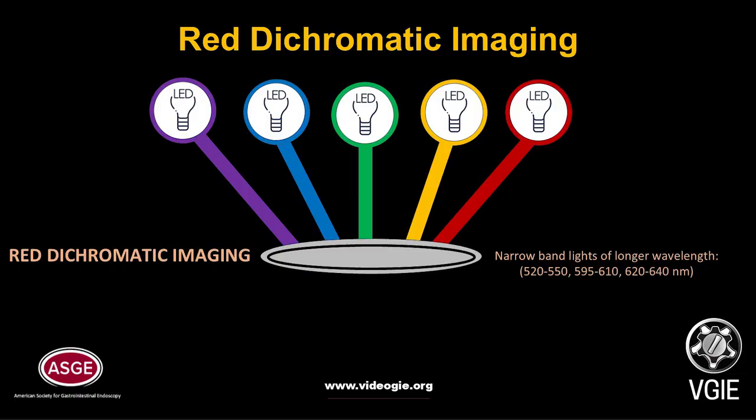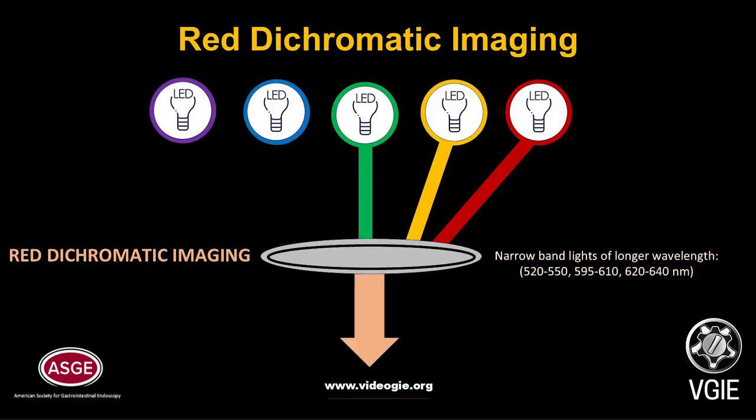Because red dichromatic imaging uses 3 narrowband lights of longer wavelengths, only 3 LEDs, green, amber, and red, emit light during observation. After the 3 LED lights are combined by dichroic filters, the spectrum of the combined light can be narrowed by the red dichromatic imaging filter and is then inserted onto the optical axis.